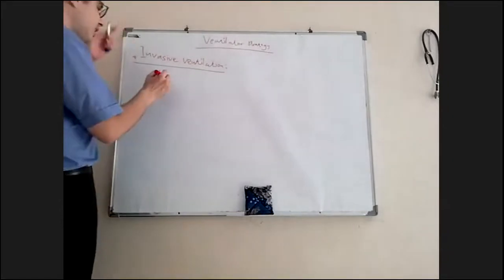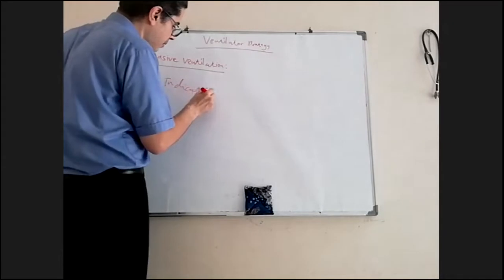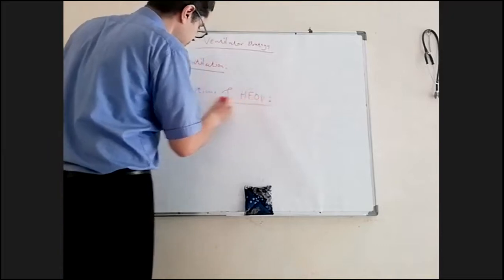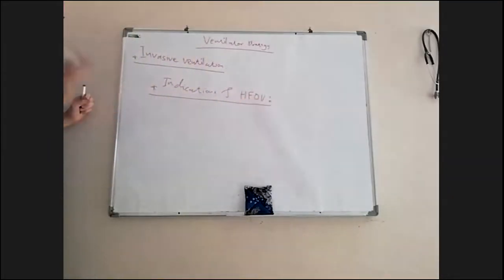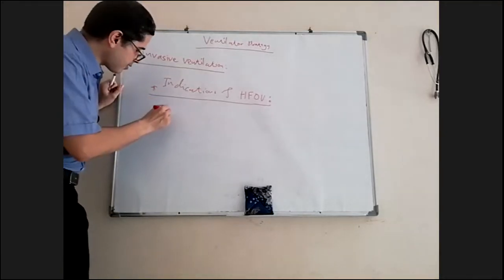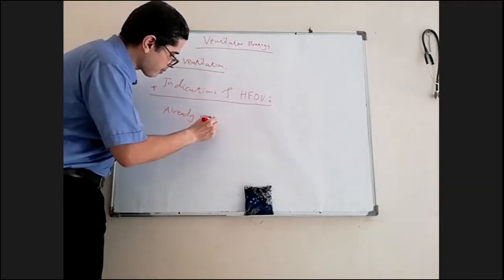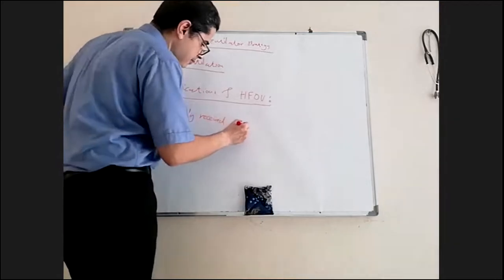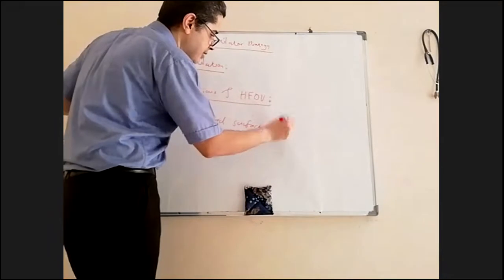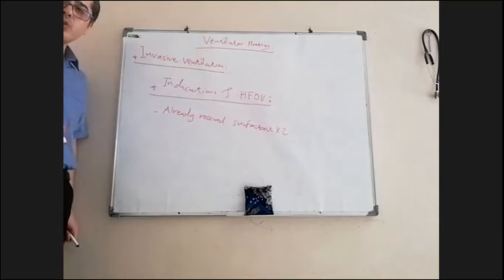So, indications of HFOV. HFOV, like I said, is not the first choice. It is indicated if your patient already received surfactant, already received surfactant twice, because we know we can add another dose of surfactant after 12 hours.